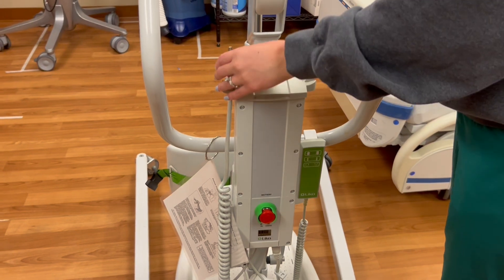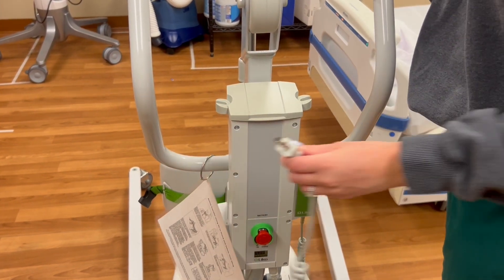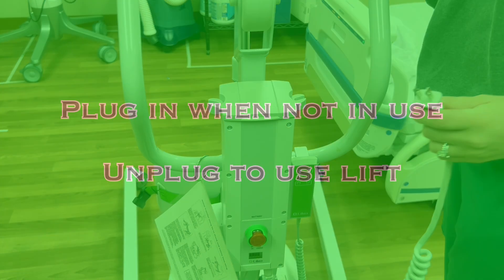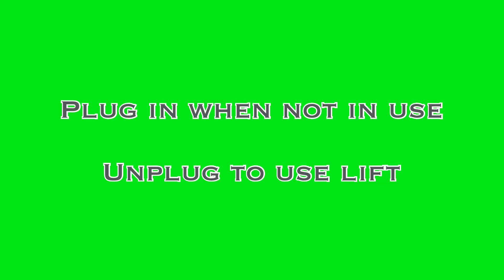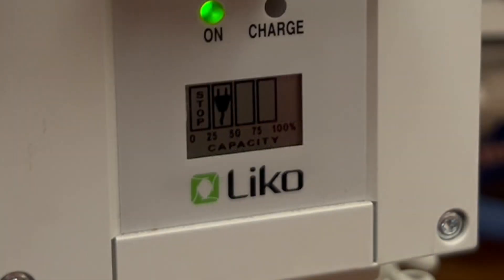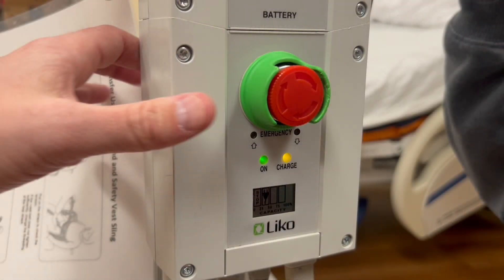As we move up the device, you'll notice a power cord. The Sabina is battery-powered. Whenever it is not in use, the device should be plugged in to ensure a charged battery, but the lift should not be plugged in during use, as it would impede mobility — just rely on battery power. There is a small screen on the back that will indicate battery charge, but when plugged in, the screen changes from percent of battery charge to a plug icon. There are also two small LEDs: a green one to indicate the device is on, and a yellow LED indicating that the battery is charging.